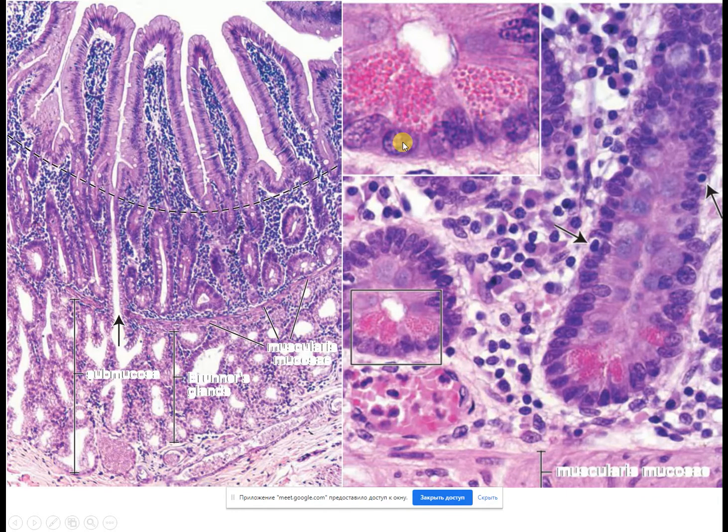Here are Paneth cells, as I said before. Paneth cells are responsible for, we don't know, it might be secretory granules here. But some other authors say that these Paneth cells collect cell walls of bacteria. Might be both of them are right, but anyway, the cells contain a very highly eosinophilic composition inside.